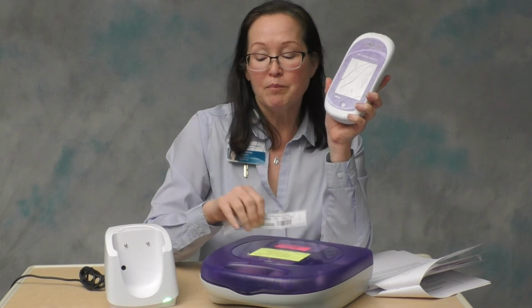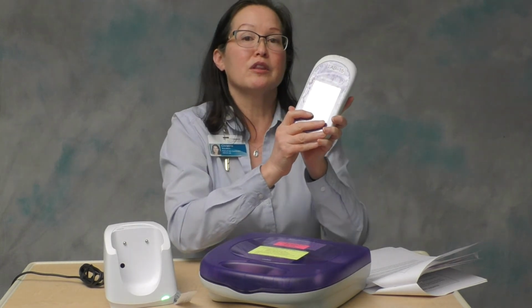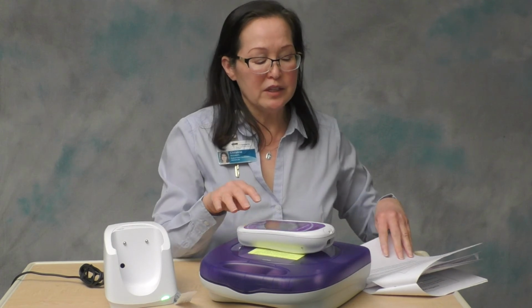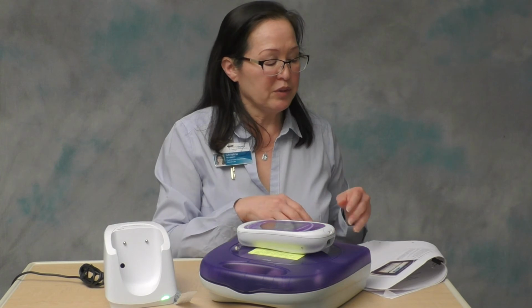We have a mechanism that will allow you to run a patient test in an emergency in case the patient doesn't have an armband yet or it won't scan for whatever reason. But please make sure that you look at the screen and ensure the name and date of birth displayed are the person that you're performing the test on in order to ensure that the result gets into the correct patient chart. So once you've verified that the name and date of birth are correct, you can hit the green check mark and proceed with testing.